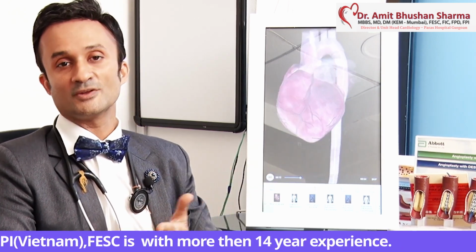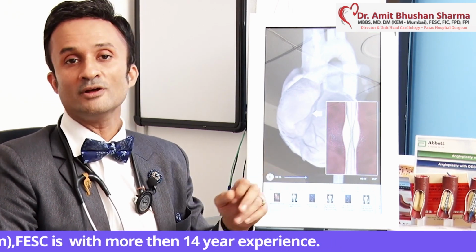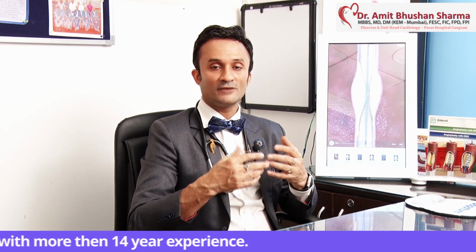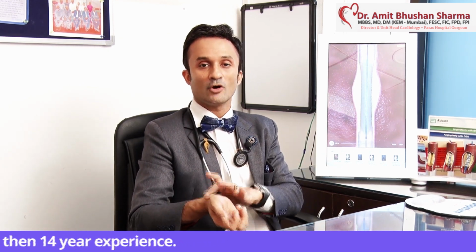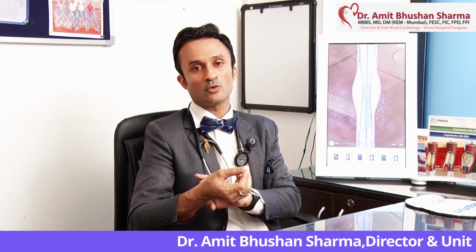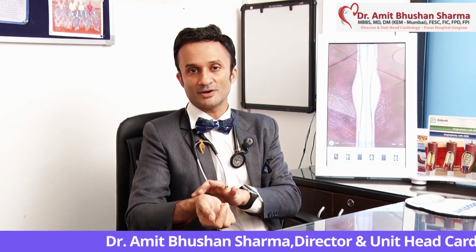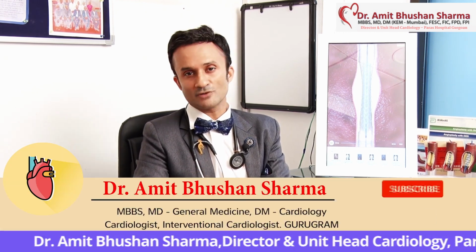In cases where the hand is fractured or when the hand vessel is very narrow, then we do the same thing through the leg. Major angiography or minor angiography, both information is the same. Advantage of a minor angiography, or a mini angiography, is that the patient can go home the same day, he can stand up and he can walk, everything is done from the wrist. The learning curve for the cardiologist is a little more, but it is very beneficial for the patient.